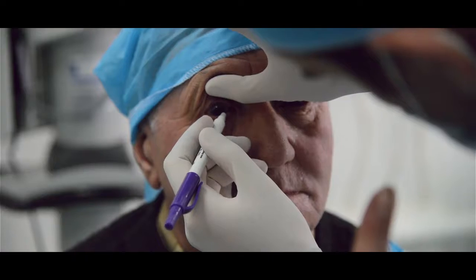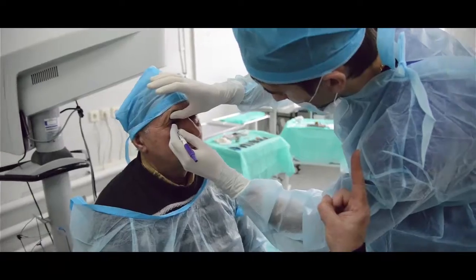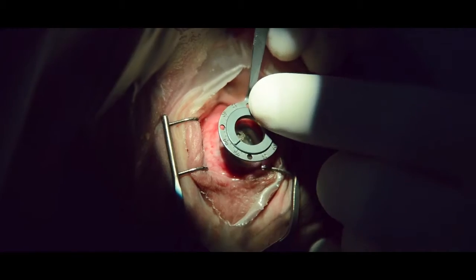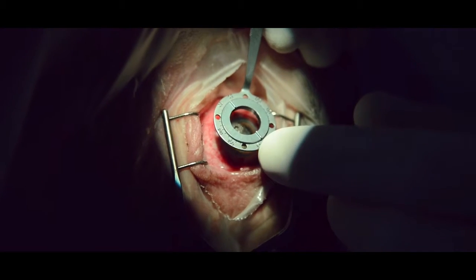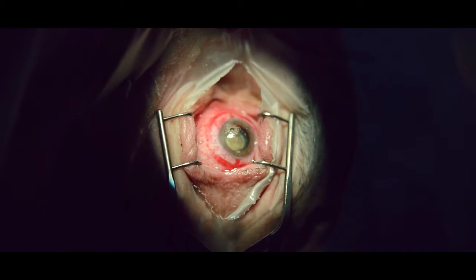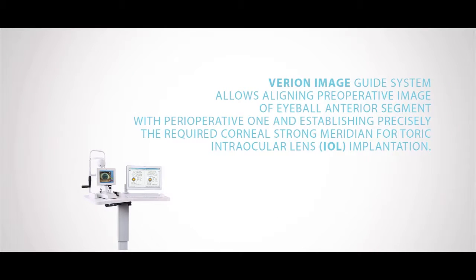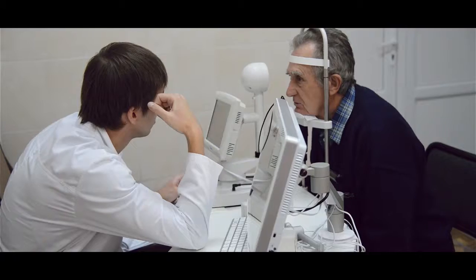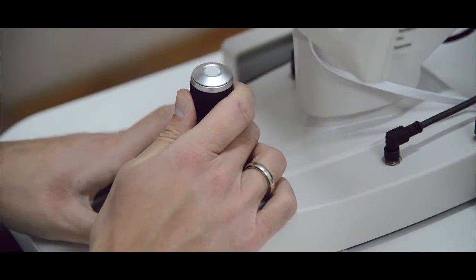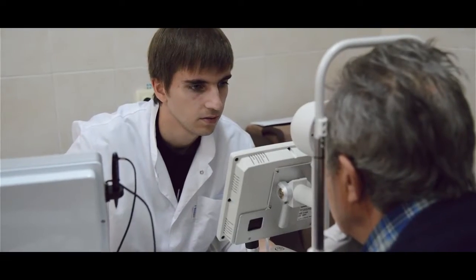The disadvantages of the manual procedure of corneal meridian marking are as follows: eyeball cyclotorsion and cyclorotation, the absence of a computed control system, patient's restlessness, absence of pronounced anatomic landmarks, and the surgeon's hand tremor. Verion Image Guidance System allows aligning the operative image of the eyeball's anterior segment with the preoperative one and establishing precisely the required corneal steep meridian for the toric intraocular lens, IOL, implantation.